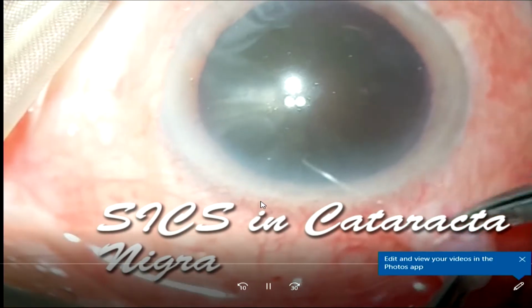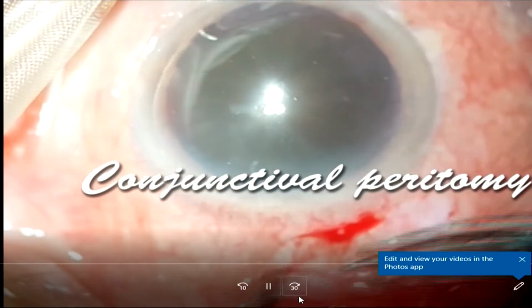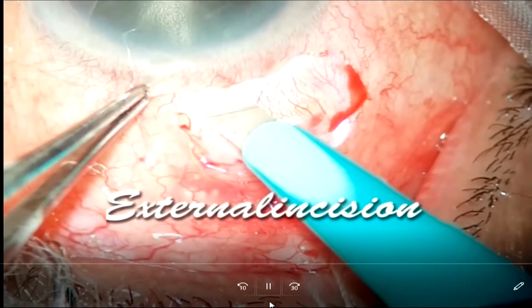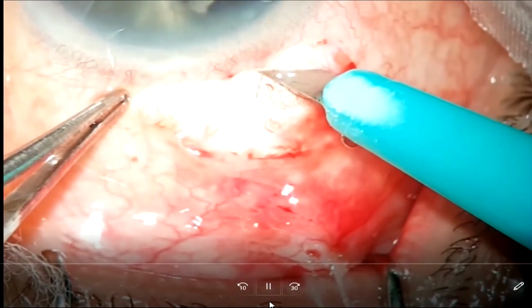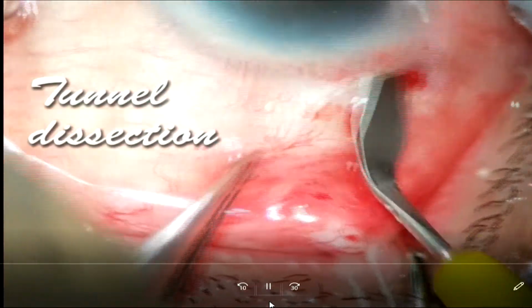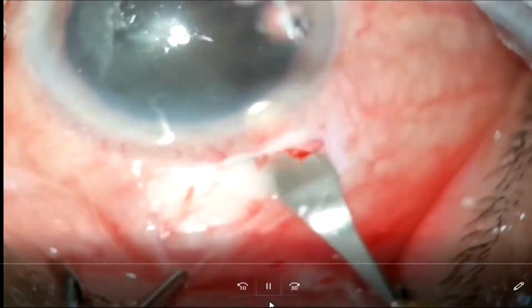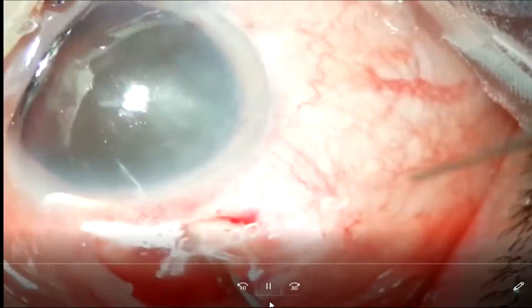So this is a cataracta nigra, and nowadays what I do is I leave a frill of conjunctiva near the limbus so that you don't harm the stem cells. It also helps in closing your wound properly, as the wound gets covered by it. This is a frown incision, and this is the 0.5 millimeter depth of the external incision, followed by a crescent knife being used to dissect further into the cornea, about 1.5 to 2 millimeter.